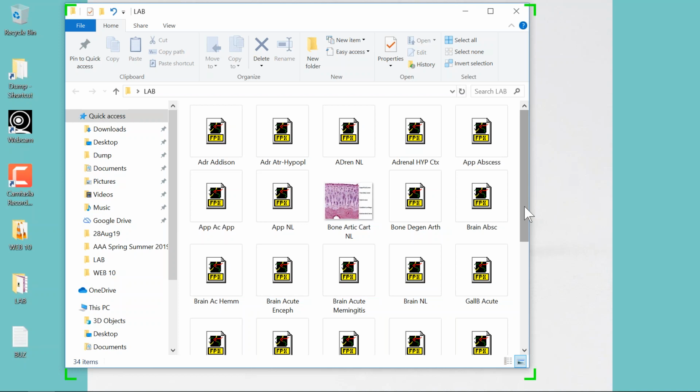Now, because you are all relatively new to microscopy, when I take all of these examples that I have been talking about over the last 9 webinars, I probably will show normal tissue as well. And rather than this being a histology lab where you have to memorize the names of all those cells, we're just going to get a visual feel for the normal features of normal tissues, and then show you some classical examples like acute inflammation, chronic inflammation, hyperplasia, metaplasia for each one.